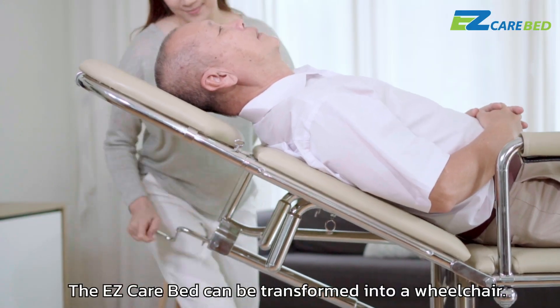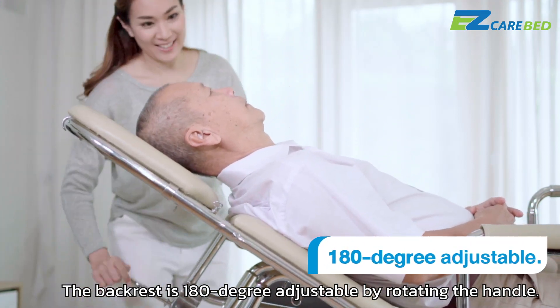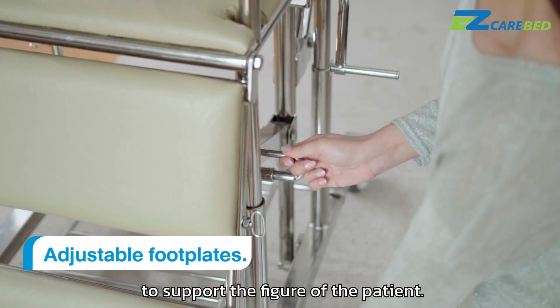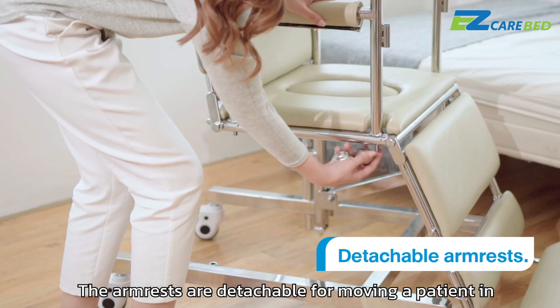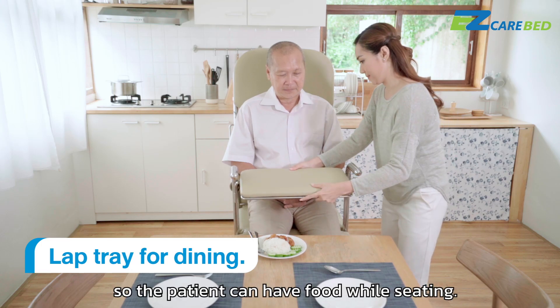The Easy Care Bed can be transformed into a wheelchair. The backrest is 180-degree adjustable by rotating the handle. Foot plates and heel supports can be adjusted upward and downward to support the figure of the patient. The armrests are detachable for moving a patient in and out of the bed with convenience. There is also a lap tray so the patient can have food while seated.